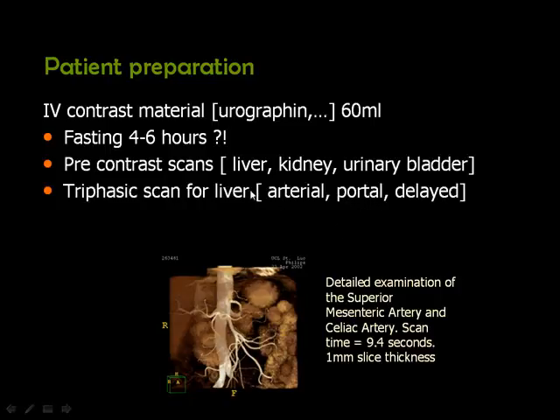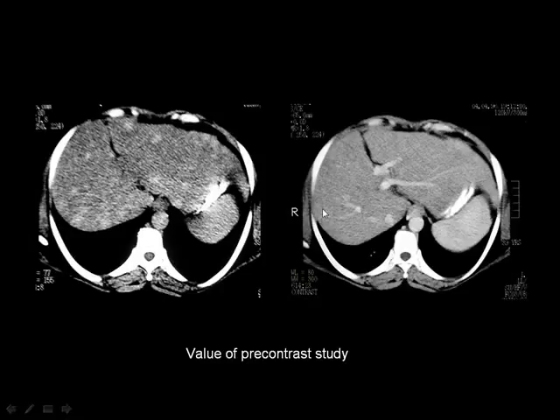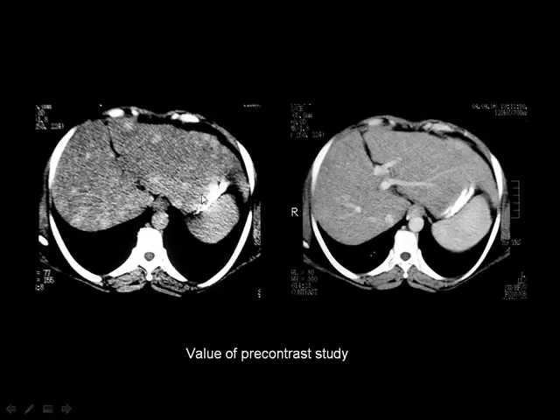We improve examination quality by taking pre-contrast scans before injecting contrast material. The reason is demonstrated by these two abdominal images: on the post-contrast image you cannot see any pathology in the liver, but on the non-contrast image you can see multiple lesions. The explanation is that if you inject contrast, the lesion and the liver parenchyma may enhance equally, making the lesion invisible. So we perform a pre-contrast study of the liver to look for lesions that may enhance exactly like the liver parenchyma.